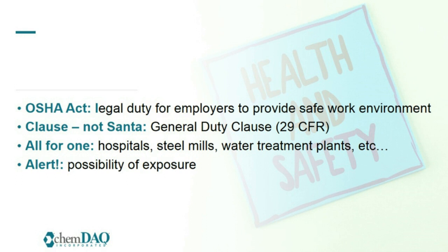The Air Contaminant Standard and the ETO standard are performance standards that set goals that leave the means to achieve the goal up to the employer. It gives the employer the flexibility to select the means best suited to their application, meaning that they can select it, but they have to select it. They can't not select it. And to me, that's kind of alerting.